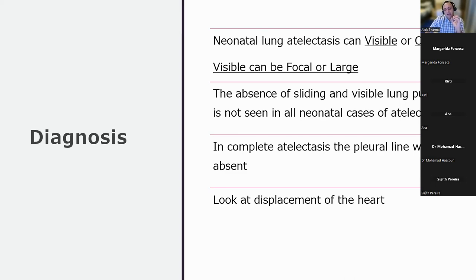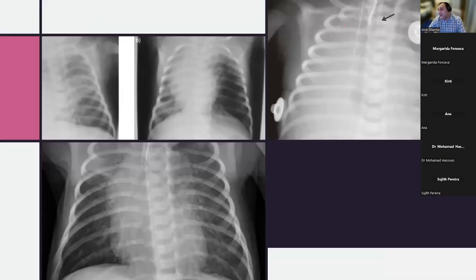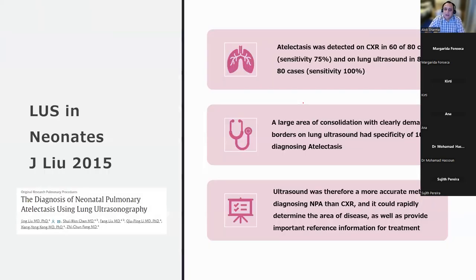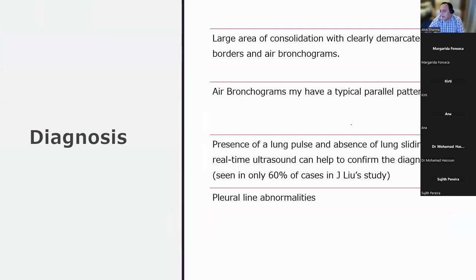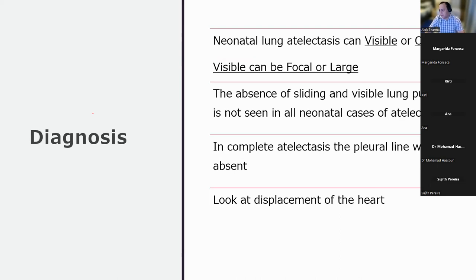And if you have complete atelectasis, and I'm just giving you an example here, assuming we know what this is at this particular point in time, if this is complete atelectasis and there's no aeration of lung, then what you're not going to be able to see is an established pleural line on ultrasound. And this we've seen a lot of today, where you cannot see an established pleural line at all because there's absolutely no aeration. Now, if there's no aeration and you don't have an established pleural line, then the atelectasis will rock and roll with the heart because of transmitted pulsations. You will not have any lung sliding.